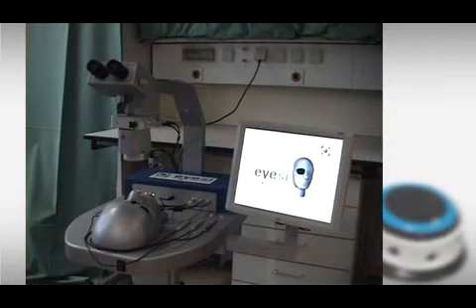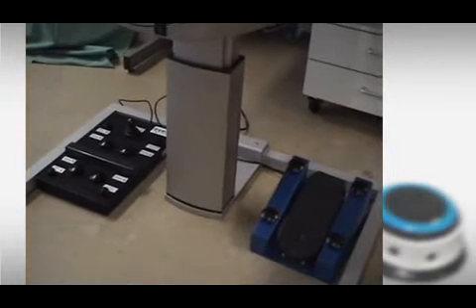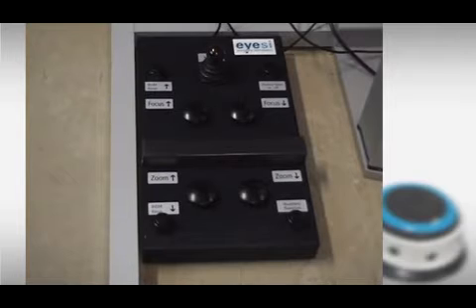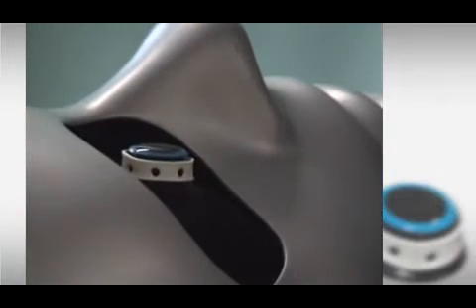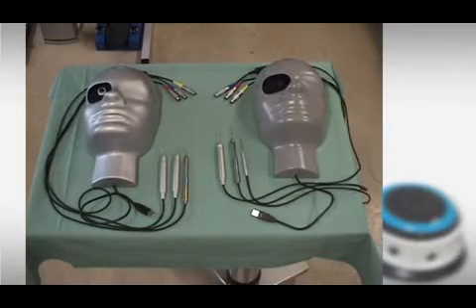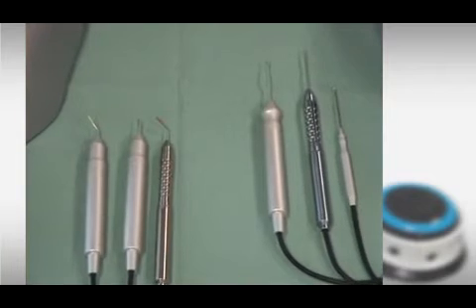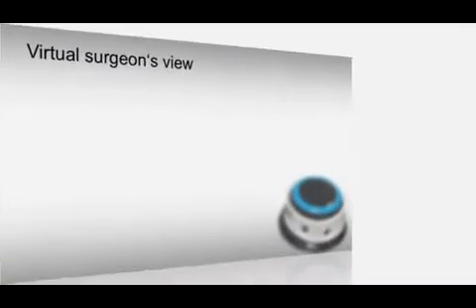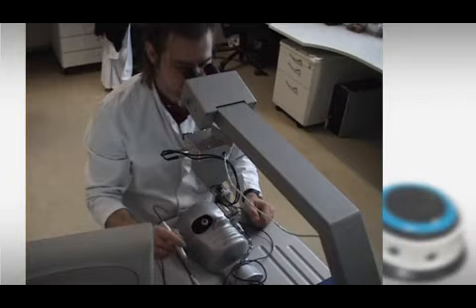It is comparable to a normal operation setup, including a phaco and microscope foot pedal with zoom and focus options. The most important part is the head with the artificial eye. There are two different head and eye models available with corresponding surgical instruments: one for the anterior and one for the posterior segment. The surgeon operates via a stereo microscope as in a real situation.